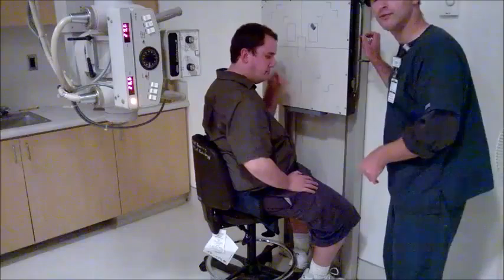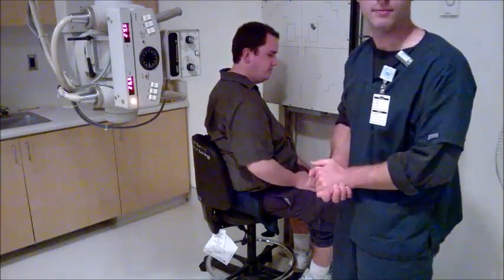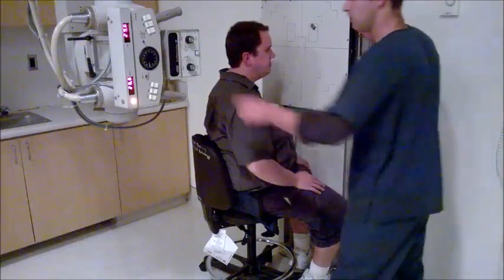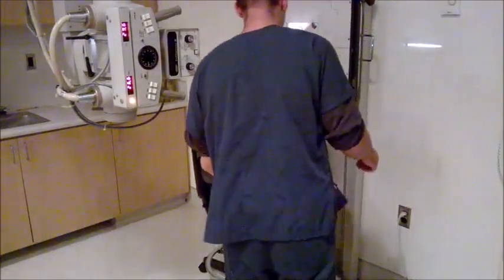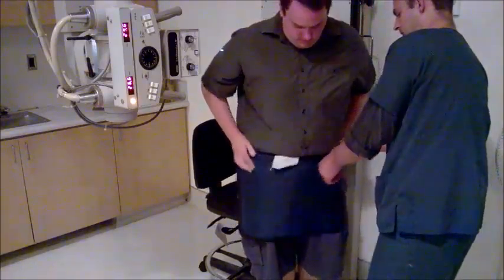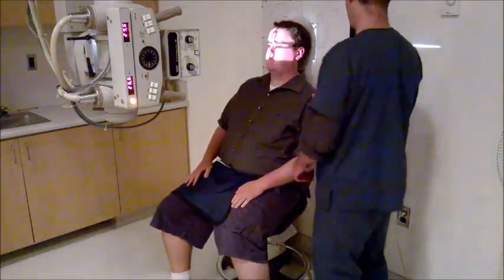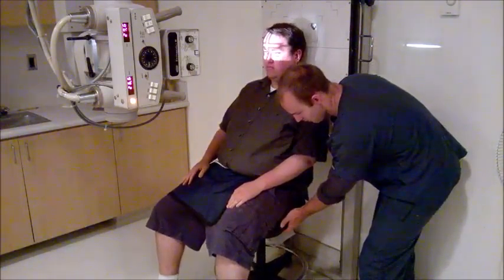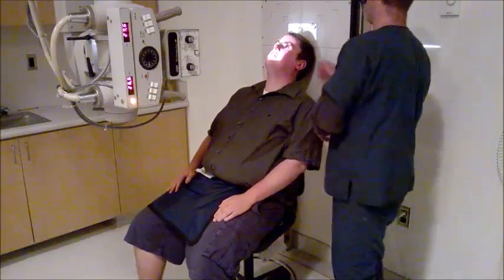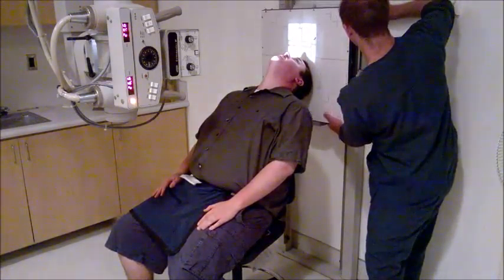Now time for my submentovertical SMV projection. So I'm going to have you stand up, sir. Alright, bring the shield around, and then place it on you. There we go. So it shields your gonads. Sit back down again, and now put the back of your head against it. There you go. Now bring the chair a little bit forward, and then lean your head backwards. Keep it there. Perfect. You're doing fine. Let me know if this hurts any.